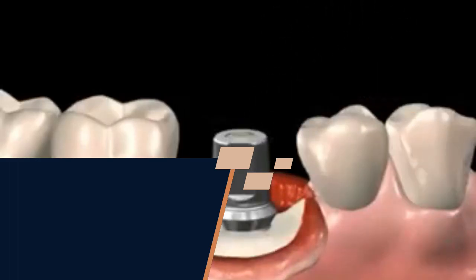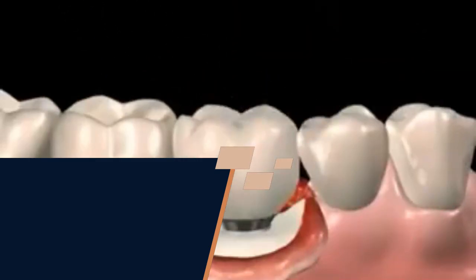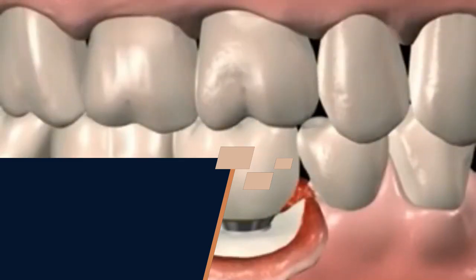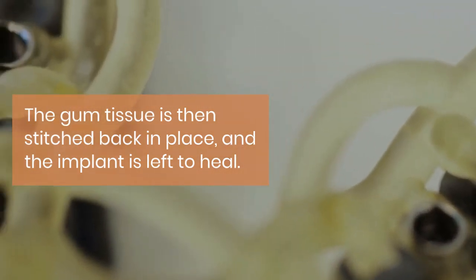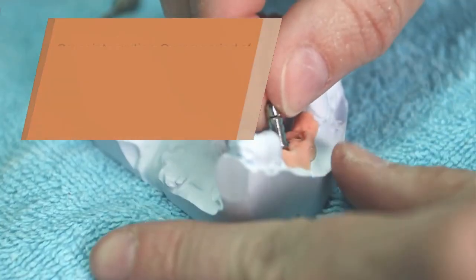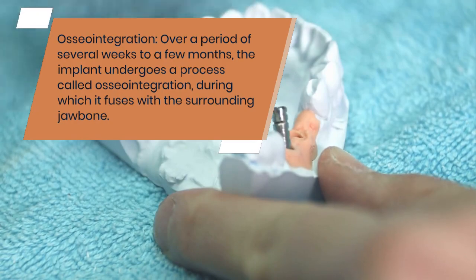Prosthetic tooth/crown placement. After a short healing period, during which the gum tissue around the abutment may be shaped and contoured, your dentist will take impressions of your teeth. These impressions are used to create a custom prosthetic tooth or crown that matches the color, shape, and size of your natural teeth. Once the crown is ready, it is securely attached to the abutment, completing the dental implantation process.